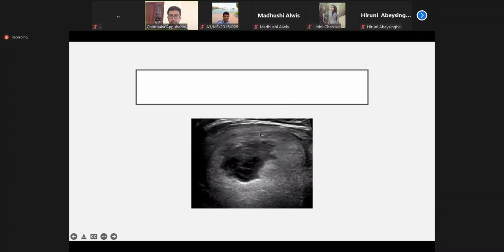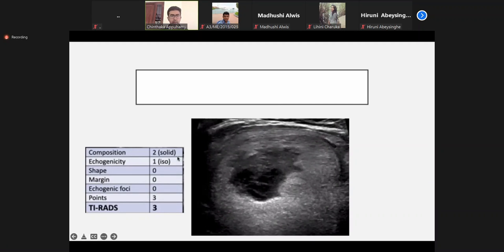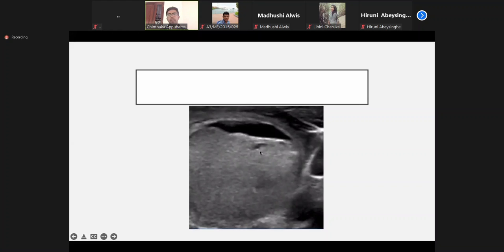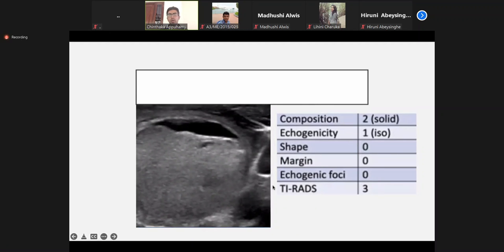This one is isoechoic compared to the surrounding parenchyma and has more solid areas, but there are cystic areas with a lace-like pattern. Composition is predominantly solid — it gets two marks. Echogenicity is isoechoic — one mark. Shape is fine; it is rounded and well-defined. Margins are well-defined. No calcifications. It carries intermediate points, so finally it comes as TIRADS 3 — probably benign category. Well-defined, predominantly solid, isoechoic, no punctate calcifications — another example of TIRADS 3.